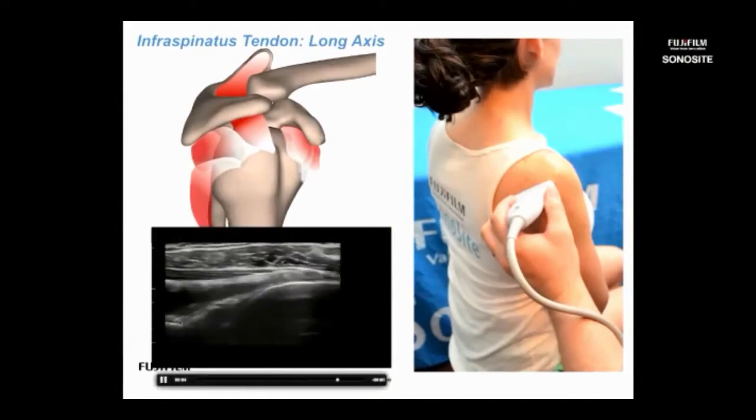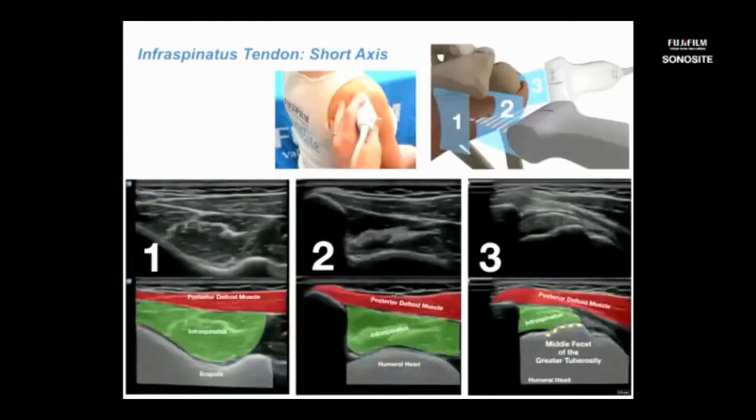When we go to live scan, I'll show you the way to get an image really, really nice with the bones laying flat with our ultrasound beam. But this is a good dynamic maneuver when you're trying to evaluate for joint effusions. When you externally rotate, that capsule will unfold. Whether it's filled with fluid or not, you're still going to see this little capsule unfold, and it's very nice. So internal external rotations will help you delineate these tissue margins. Also on external rotation, there's a vein that dilates, and we'll cover that in the live scan.